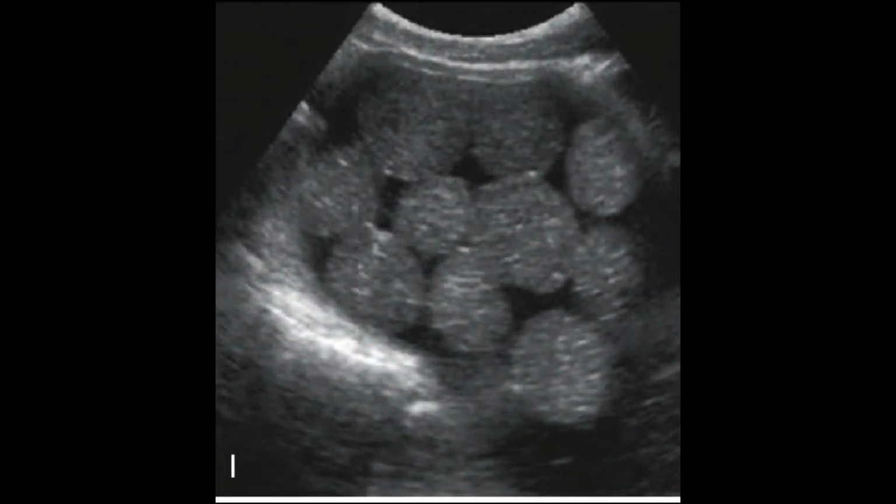This is a very unusual pattern. This is actually a transabdominal scan, and on this transabdominal scan you can appreciate multiple mobile spherical echogenic structures floating in the large cystic pelvic mass. This was a large cystic mass seen in the pelvic region, and within it you can appreciate that these round spherical echogenic lesions are floating within the cystic lesion.